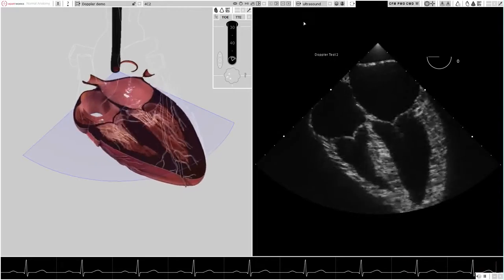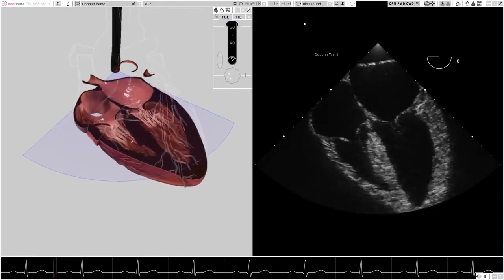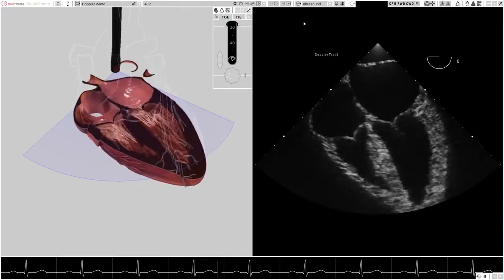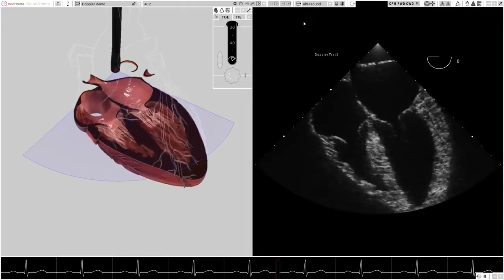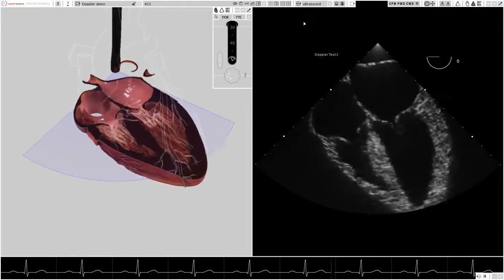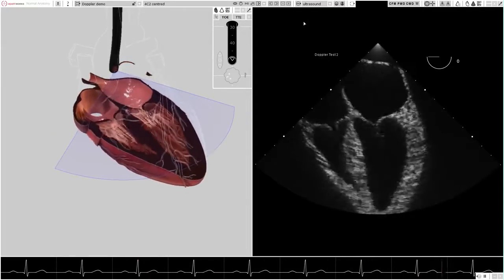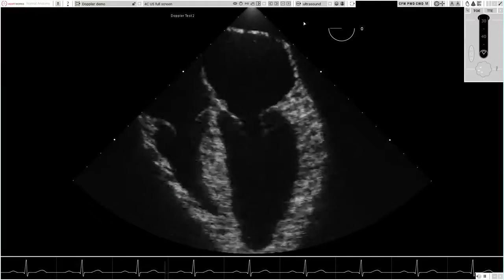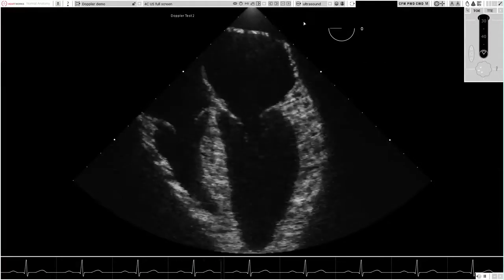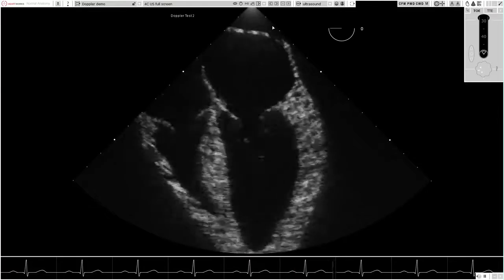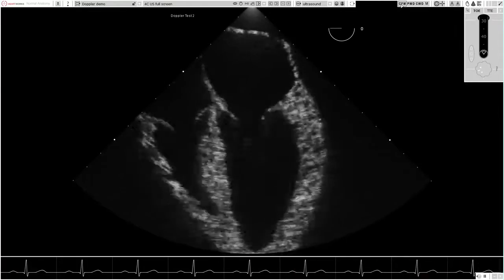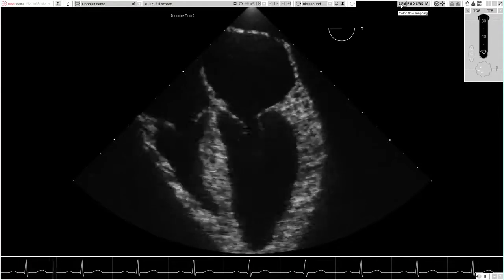Doppler imaging is the latest development of the HeartWorks ECHO simulation system. This complements the existing suite of normal and pathological hearts, including the simulated 2D and M-mode imaging. The imminent introduction of simulated Doppler imaging to the HeartWorks system will further elevate the educational value of this outstanding training tool.